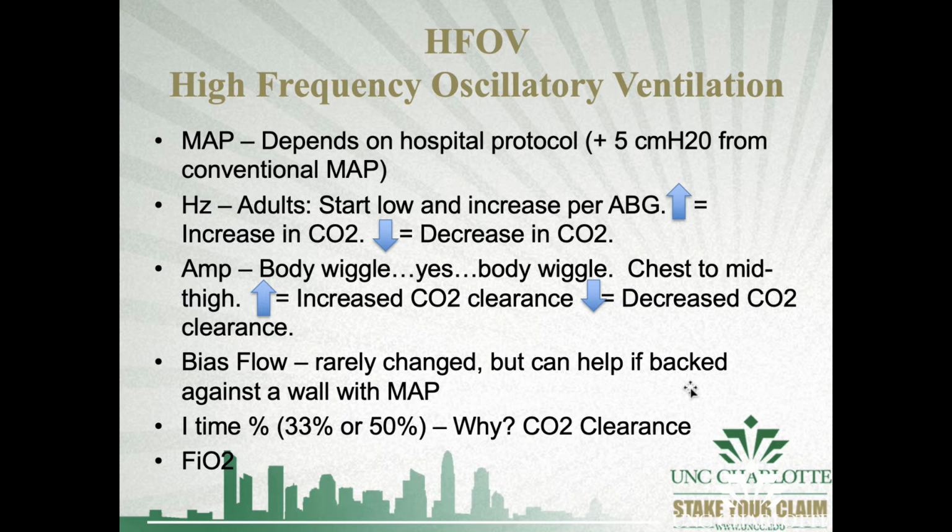The goal of the oscillator is to provide as much distension and oscillatory demand or supply as we can to protect our alveoli, okay? The more shaking we have going on, the more distribution of gas, the more efficient opening of our alveoli, and the more protective mechanism within our alveoli, because they almost self-regulate. We'll get into that a little bit later.